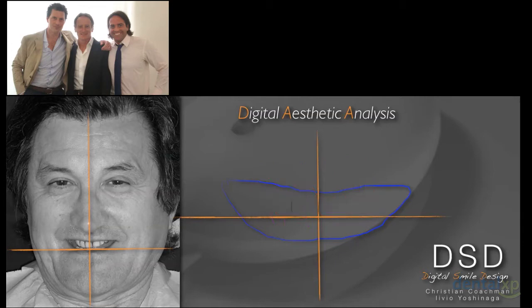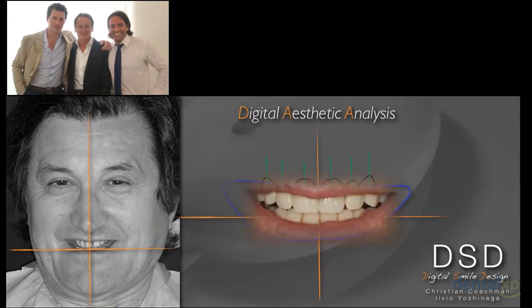We can see if everything is correct. We can try to put the teeth in the correct position, with the correct occlusal plane, with the correct midline, with the correct axis, and we can try to show this to the patient to make him understand what we can do for him. And we can also try to show him what we can potentially do for him.